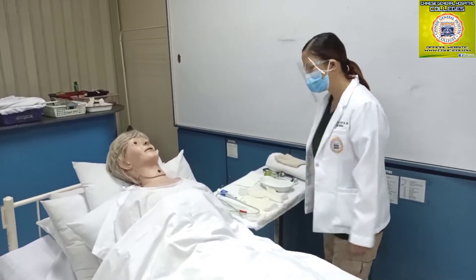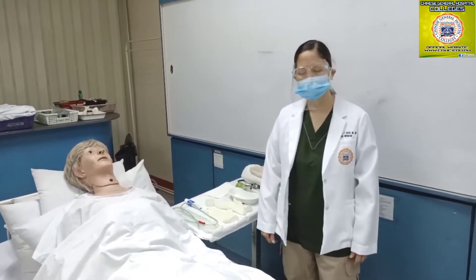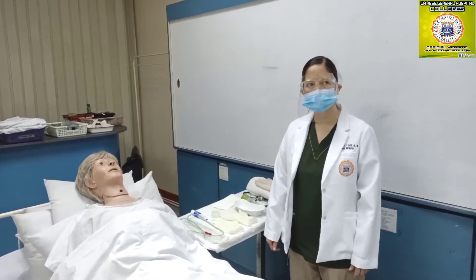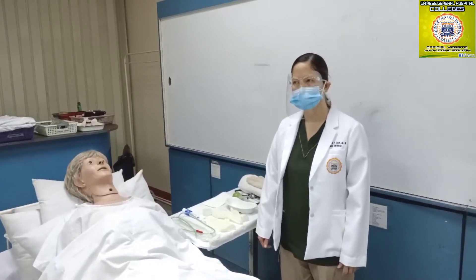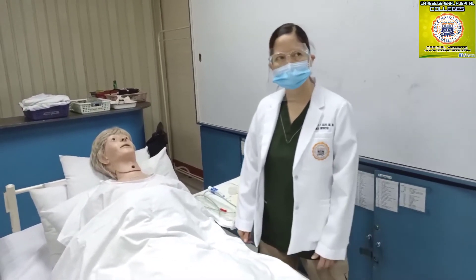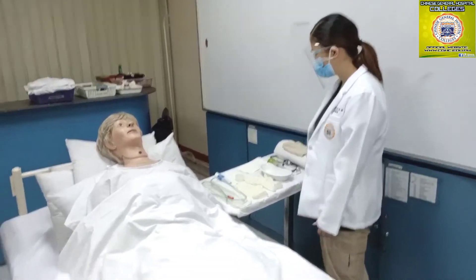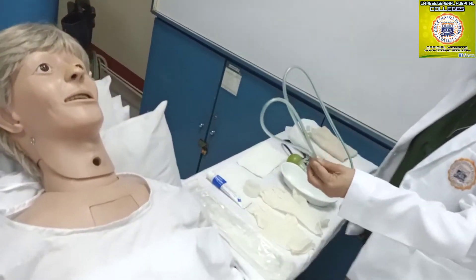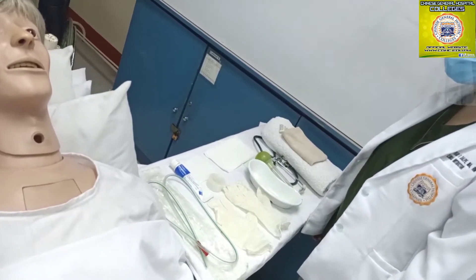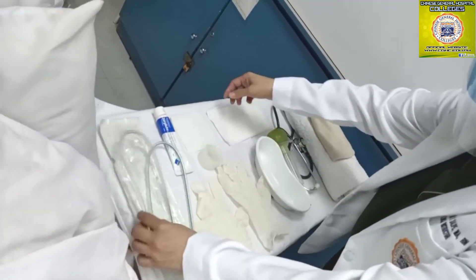The first step is to check the physician's order. Check hospital protocol about NGT insertion and removal. Explain the procedure and its purpose to the client, then gather equipment such as the NGT. For NGT insertion, make sure you have your appropriate size nasogastric tube and lubricant placed on a sterile surface.